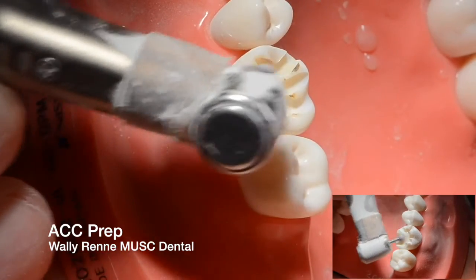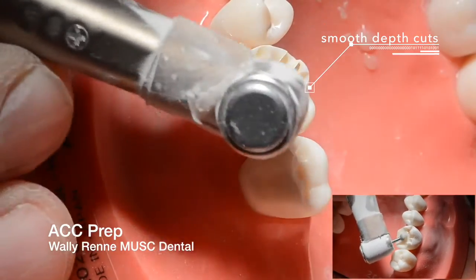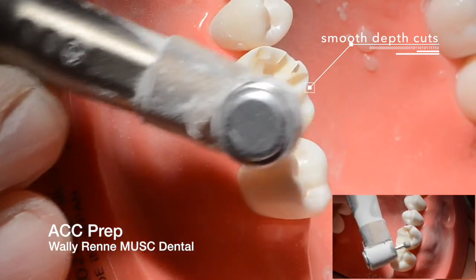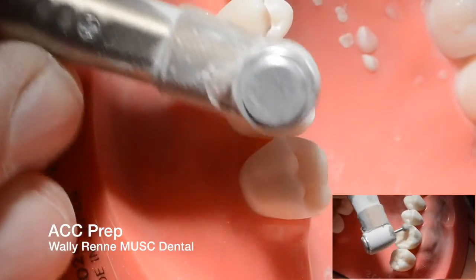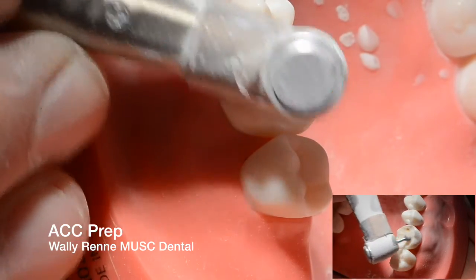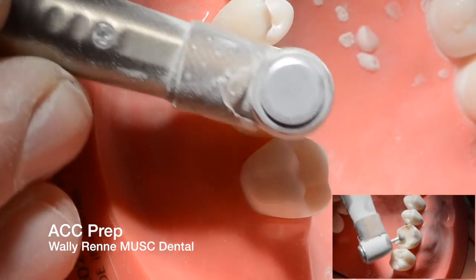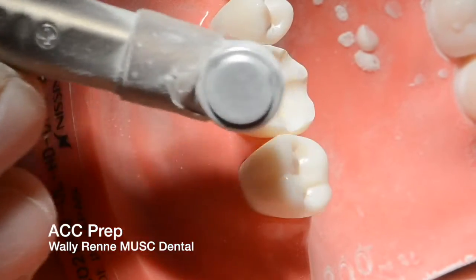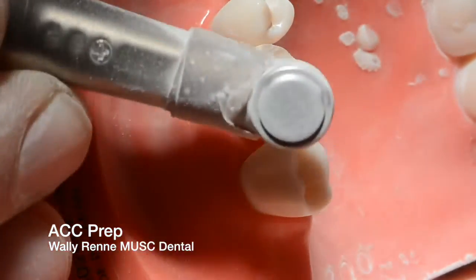The bigger the bur, the smoother and faster it cuts. I'm using this big microphone diamond here, and you could also use a football diamond if you're uncomfortable with this MAC bur. You're using smooth, fluid movements, trying to make it so you can't see those depth cuts anymore. In the end, you should have a basic plus-sign type anatomy for mandibular molars.